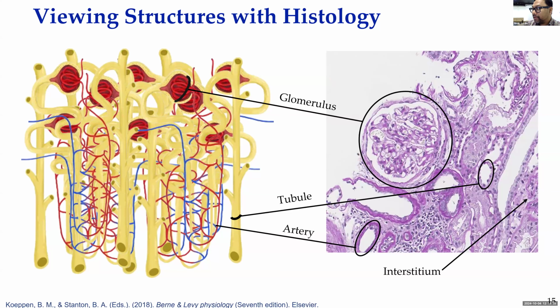And to give a complete picture, when we talk about pathology, this is one 2D cut of this histology tissue, which shows different areas of the kidney, these nephrons. This is a glomerulus, and this is one of the tubules in a 2D cut, whereas what you see is really a 3D system.